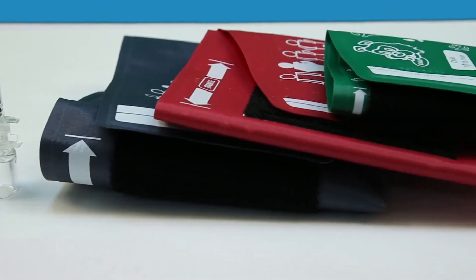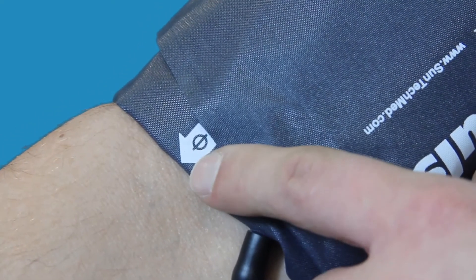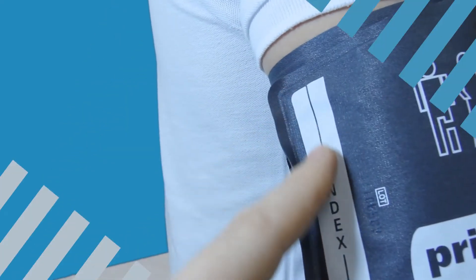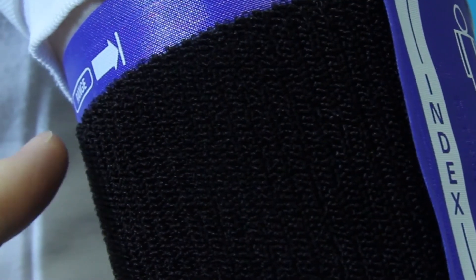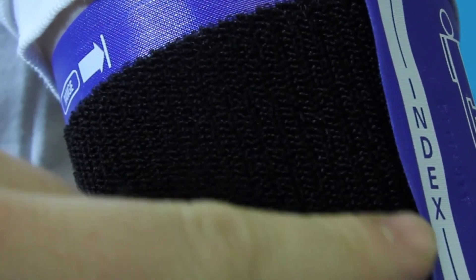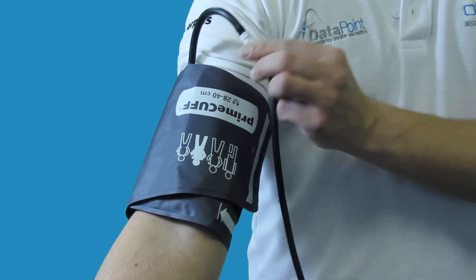To achieve accurate readings, the right size of cuff needs to be selected. Index markers on the cuff should be aligned with the patient's artery, and range markers will verify if the correct cuff size is used. Common mistakes for inaccurate NIBP measurements include using wrong cuff sizes or misplacement of the cuffs, as shown on screen.